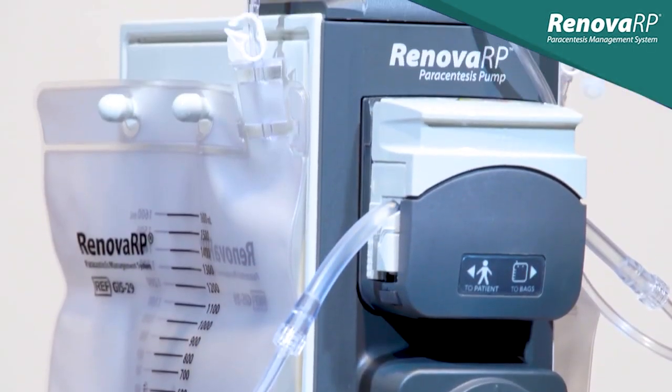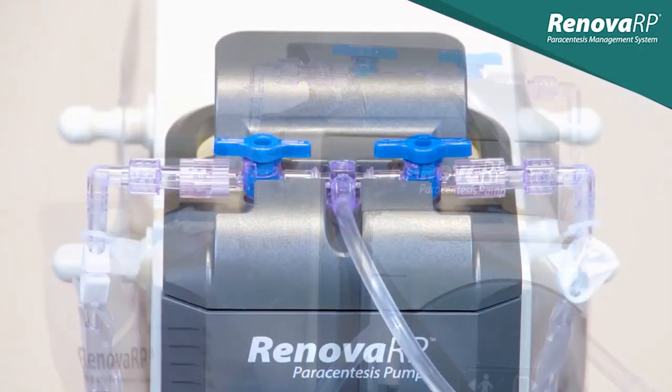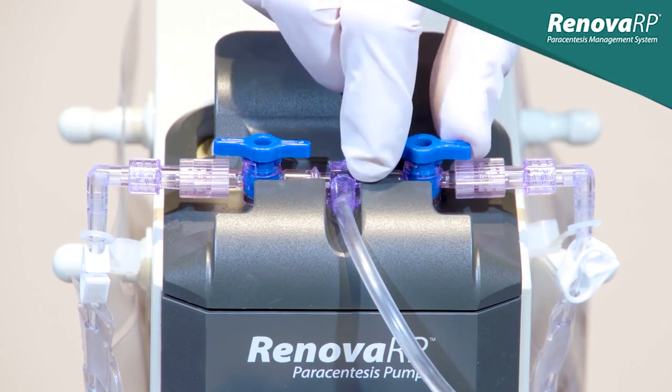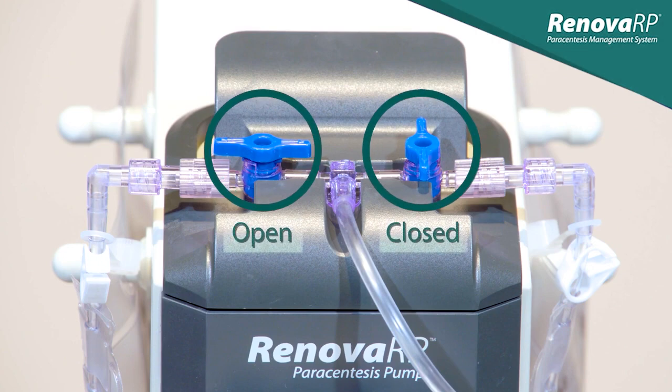When both bags are securely connected, let's take a look at the position of the stopcocks on the T-connector. The tubeset comes with both stopcocks in the open position. To maximize efficiency, we will close one stopcock to direct fluid to a single side, allowing us to stagger bag changes and not stop our procedure. We want to always ensure that at least one stopcock remains in the open position at all times while the pump is in operation.